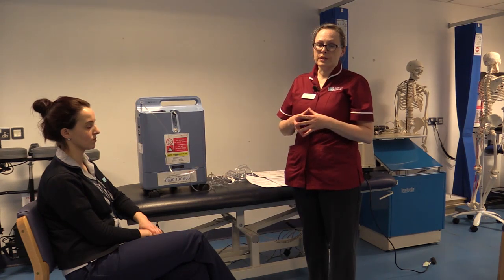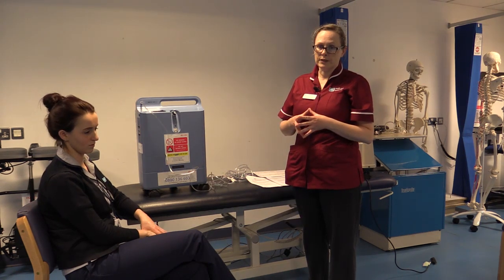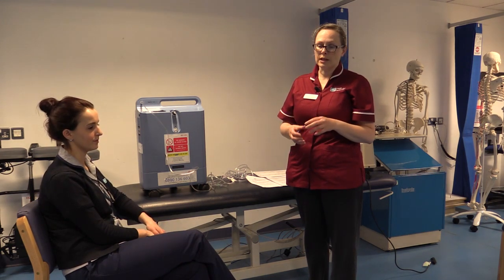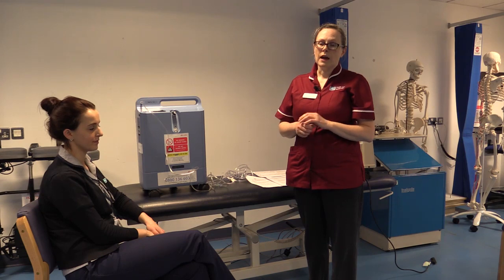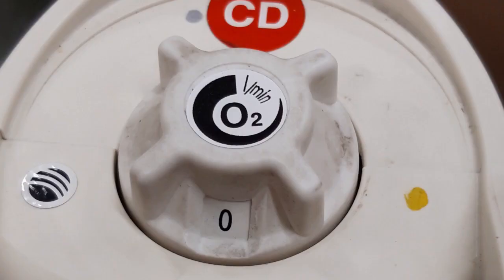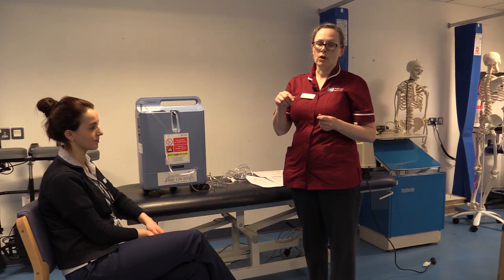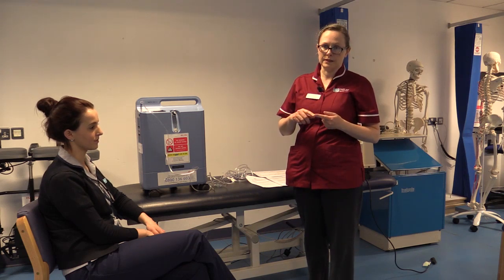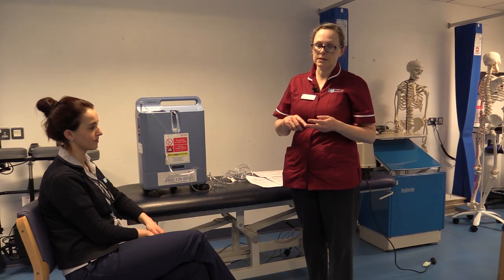For some patients who need oxygen for mobilising or for activity, they will have small white cylinders within the home. These cylinders are kept upright at all times, and when they're ready for use, the valve will be unlocked to the left-hand side of the cylinder, and on the top there will be a regulator for you to adjust the flow, going from 1 to 15 litres depending on the prescription. On these cylinders they will also have a fire break and most likely nasal cannula. Some may have oxy masks.